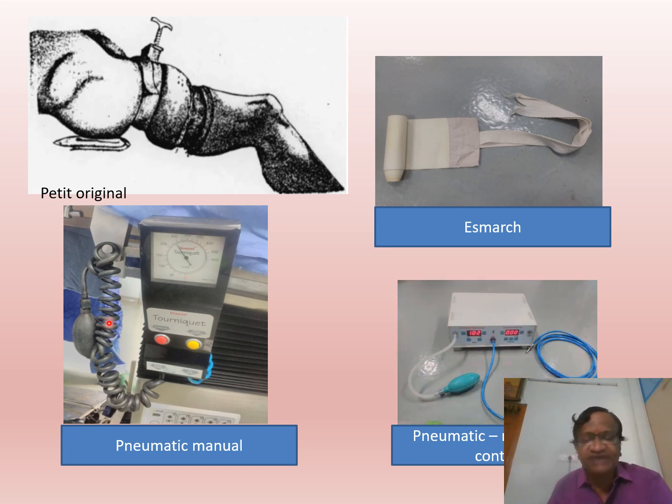Now we have a lot of electronic equipment where the control itself is more of electronics. We just touch a switch. There is no pressure like here. Here, many times we need to touch it. It inflates and finds out these things.